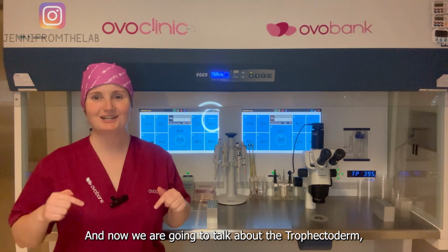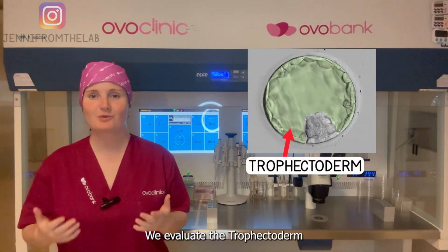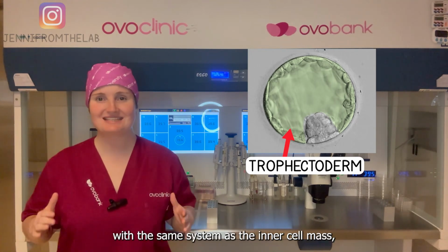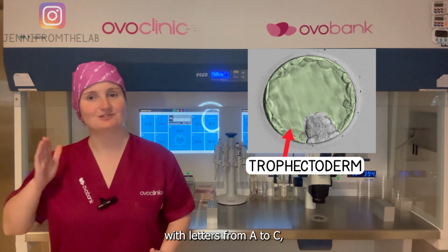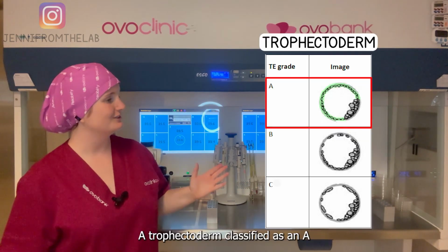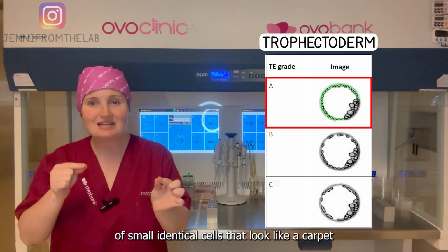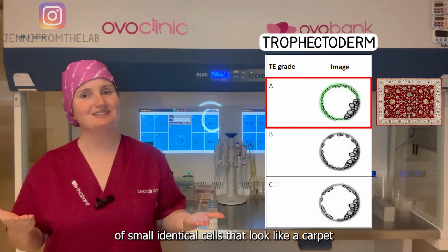And now we are going to talk about the trophectoderm, the structure that will eventually become the placenta. We evaluate the trophectoderm with the same system as the inner cell mass, with letters from A to C, with A being the best. A trophectoderm classified as an A would have a continuous layer of small identical cells that look like a carpet.